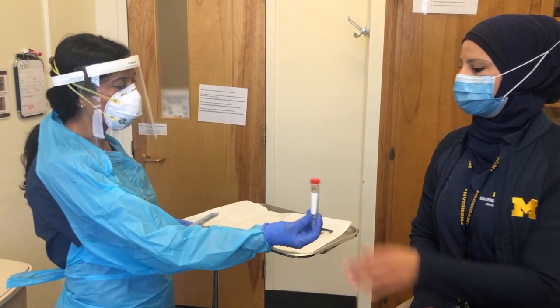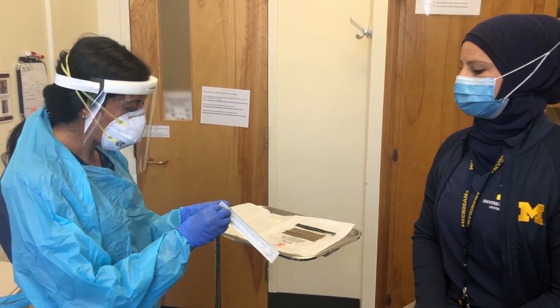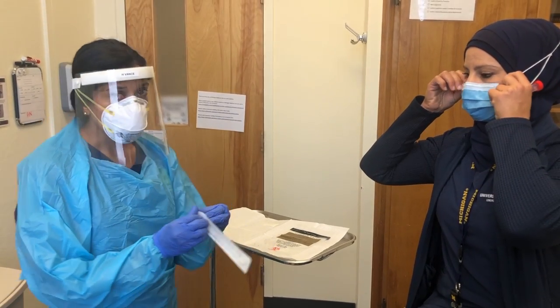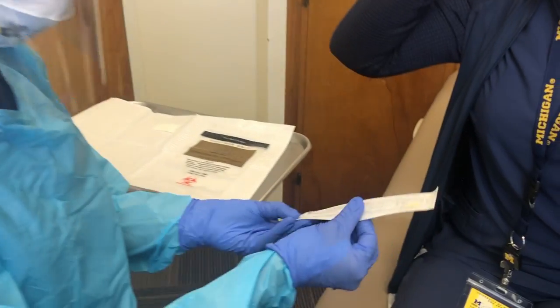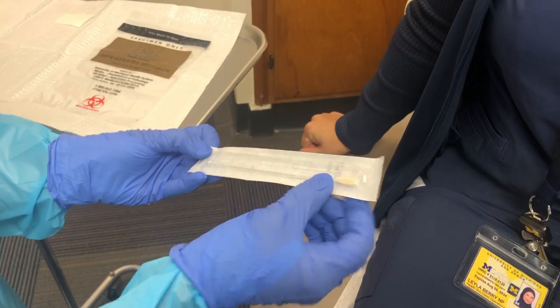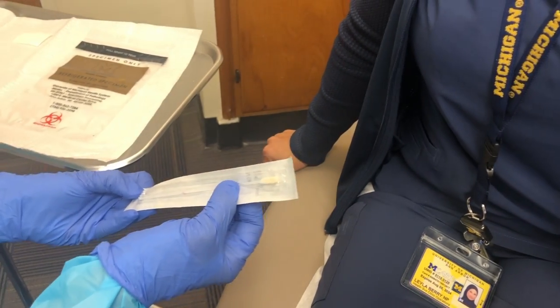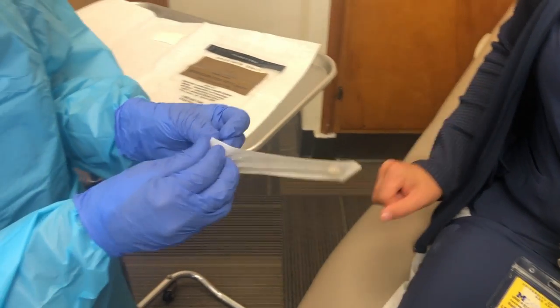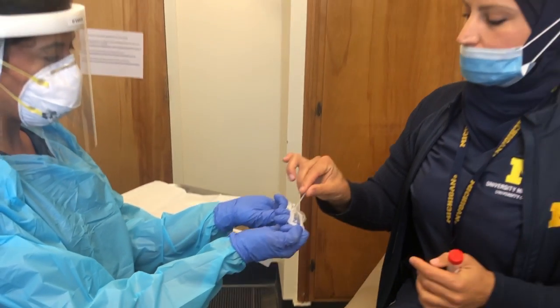So I'm going to have you hold on to your own tube, and I'm going to open this for you. It's always a good idea to show your patient about how far in you're talking. So when we're looking at the swab, nothing is marked at 3 to 4 centimeters. So I would tell her, this is about how far you want to go in or until you meet resistance. I'm going to open it so that she touches the swab and I don't.